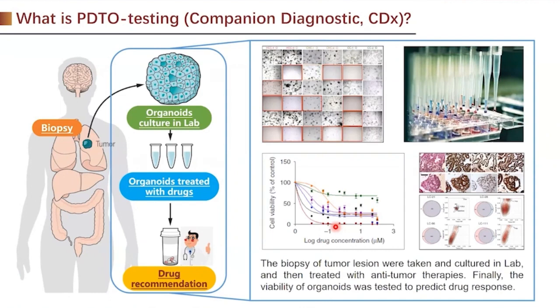The workflow of PDTO testing is just like conventional tumor CDx. The only difference is that the biopsy requires a fresh and viable specimen for organoid culture.